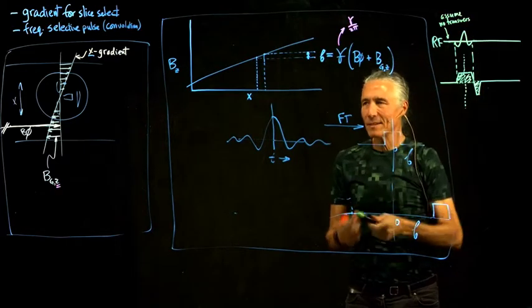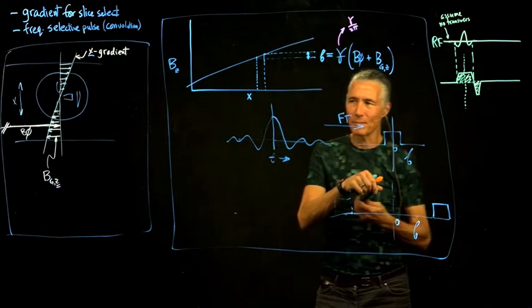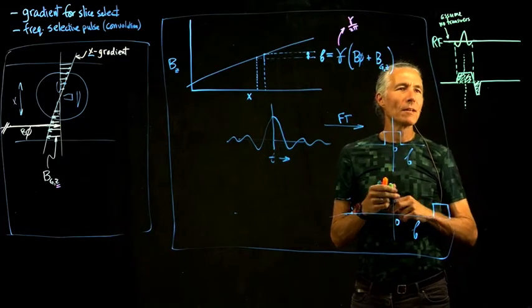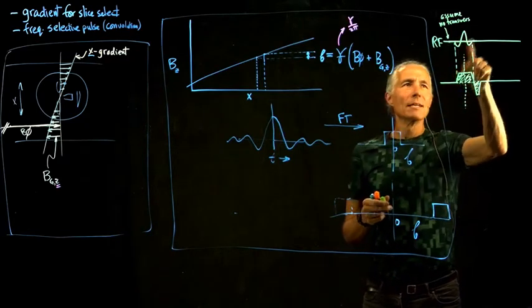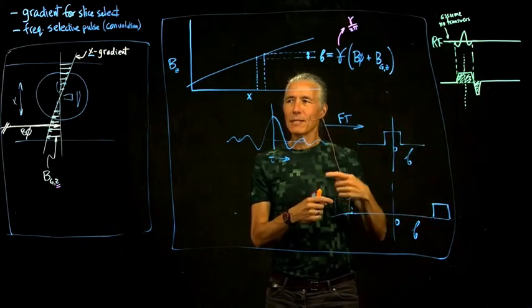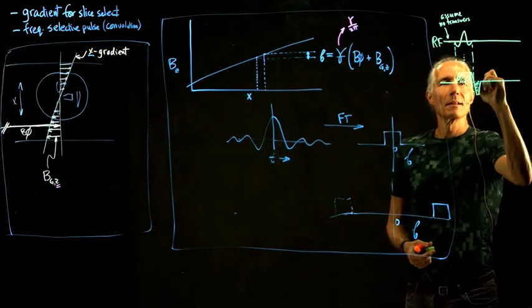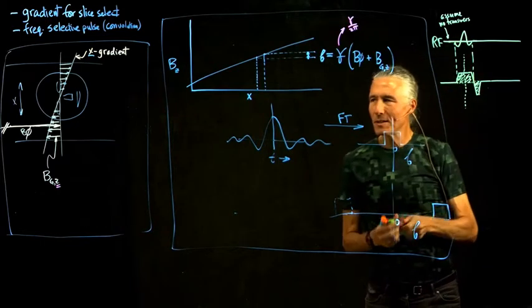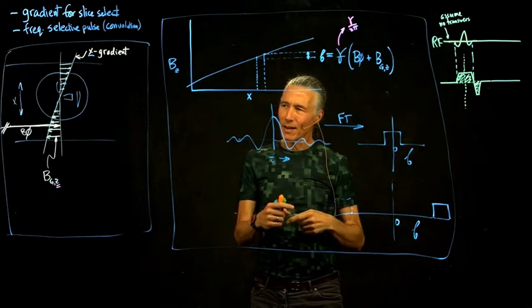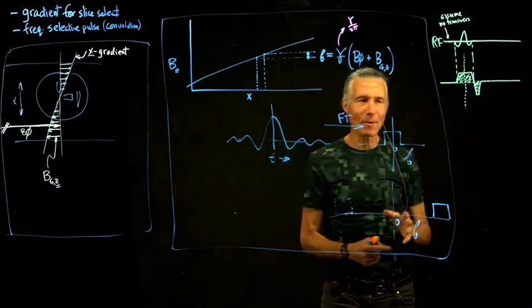So everybody's out, that means everybody's out of phase. Say there's no T2, hidden T2, it's just everybody's completely messed up, and they're all evenly distributed around the XY circle. So now we turn on the RF pulse, and the RF pulse starts sweeping them together into some coherent oscillation. But it takes a while to do that. And now they're swept together in some coherent oscillation, but then the gradient is on, and the gradient is messing them up. So the RF is kind of like lining them up, and the gradient is messing them up.